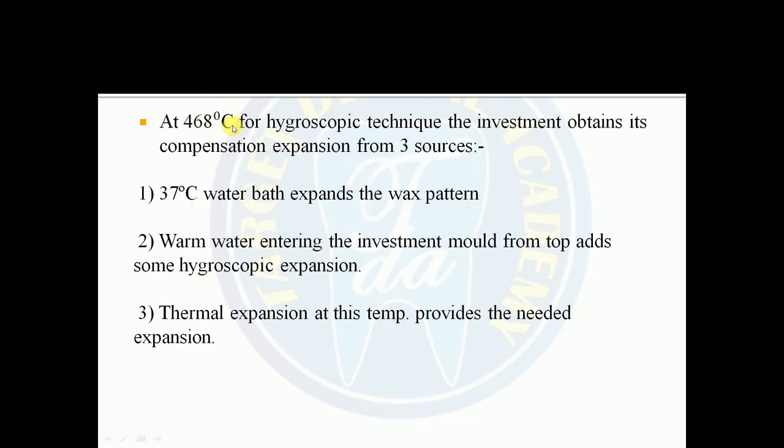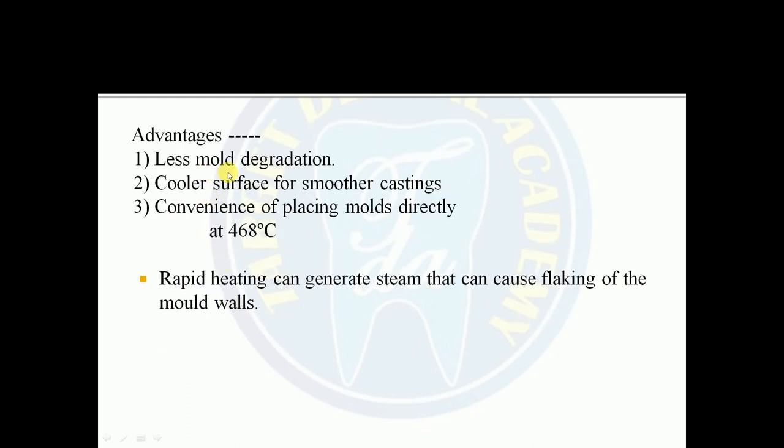At 468 degrees Celsius for the hygroscopic technique, the investment obtains expansion from three sources. The 37 degrees Celsius water bath expands the wax pattern. Warm water entering the investment mold from the top adds some hygroscopic expansion. Thermal expansion at this temperature provides the needed expansion. Advantages are less mold degradation, a cooler surface, and the convenience of placing molds directly at 468 degrees Celsius. Rapid heat can cause flaking of the mold walls.